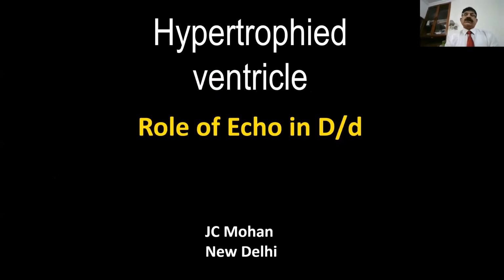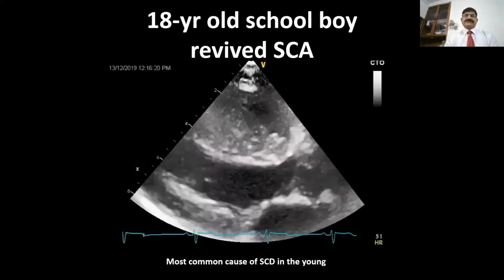We would be talking about thick-walled ventricles, the role of echo in differential diagnosis. As you know, hypertrophy actually means increase in left ventricle mass, and that may be there without increase in wall thickness. So today's topic is primarily about thick-walled ventricles and their differential diagnosis.